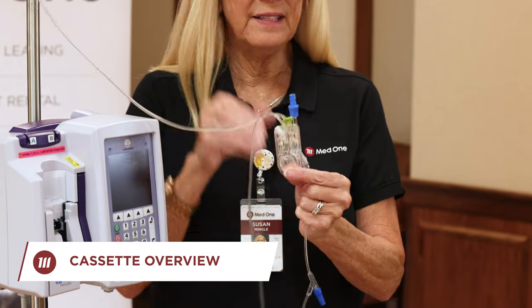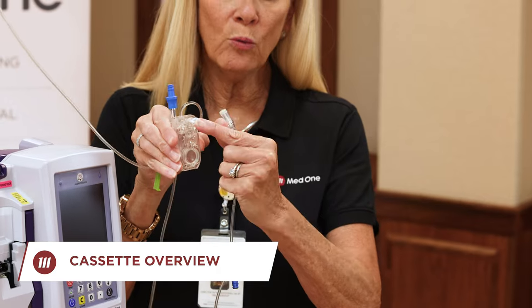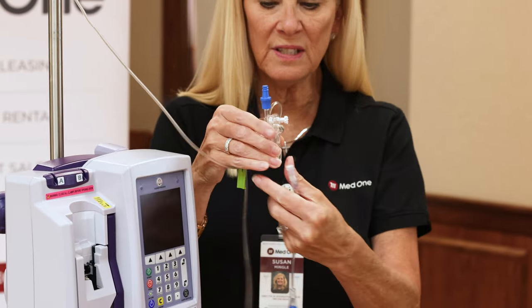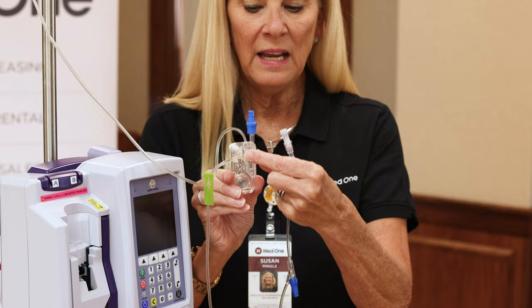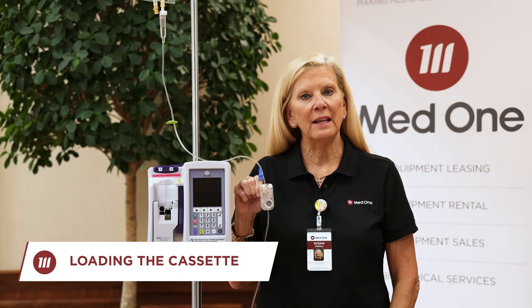Let me show you a little about the cassette. There is a clave on top, and you have your flow regulator — once you're through priming, push it all the way in so fluid will stop. On the back side is what's called the finger grip; that's how we're going to load it into the device.